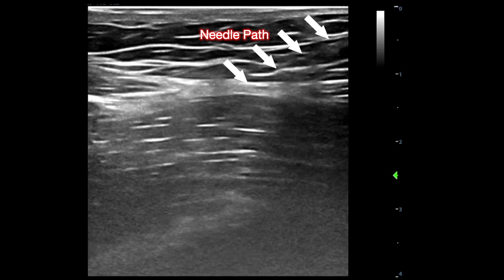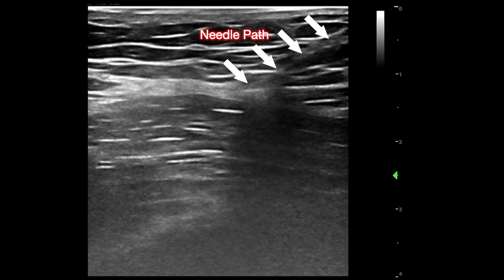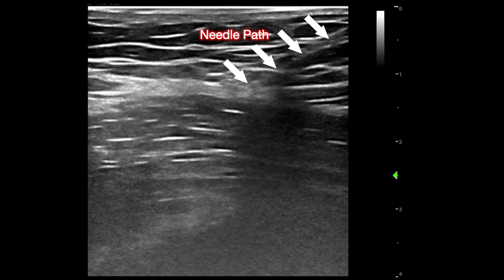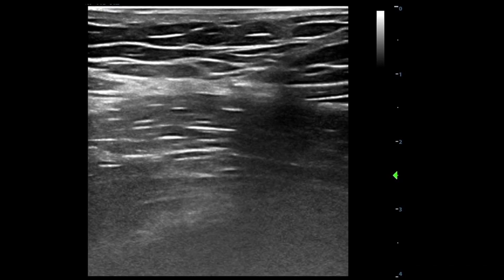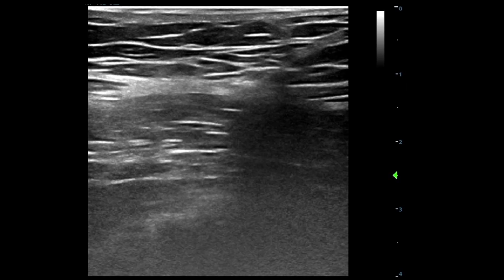An 85mm needle is inserted in-plane cranially to be placed deep to the fascia iliaca. Because of the patient's habitus and post-op edema near the surgical site, the needle has been inserted from a more distal site than is typical. The probe is slid distally to show the needle and its subsequent entry deep to the fascia iliaca.